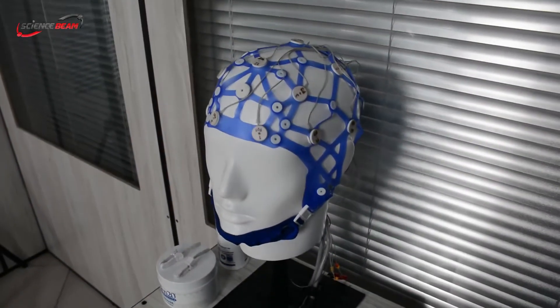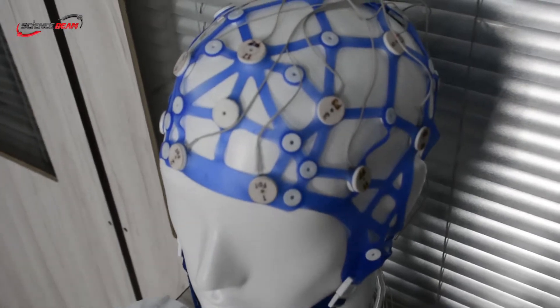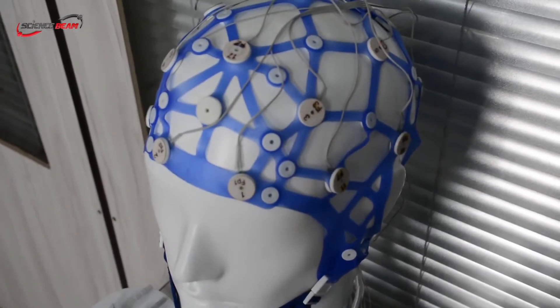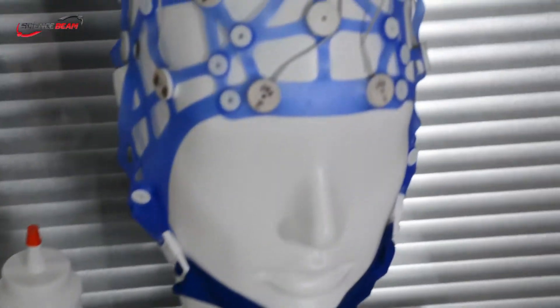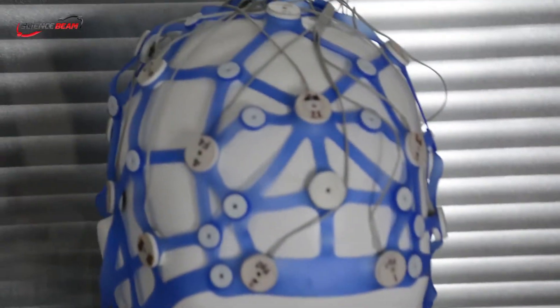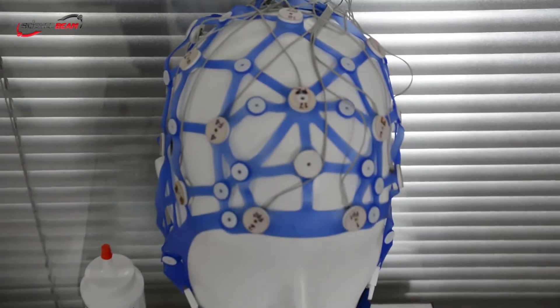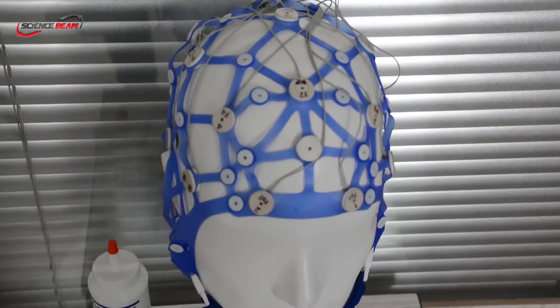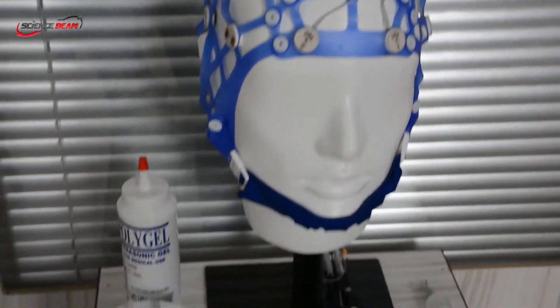To start recording EEG you need an EEG cap, namely ECAP, that is also designed by ScienceBeam for consistent and noise-free signal recording. This silicone cap is designed based on the international 10-20 standard and is washable. There are three sizes of EEG cap: small, medium and large. Medium size fits most adults.